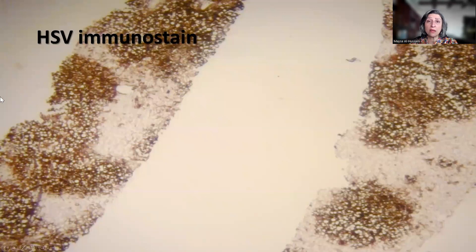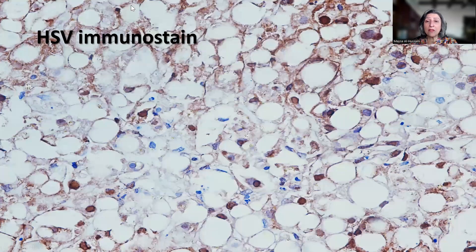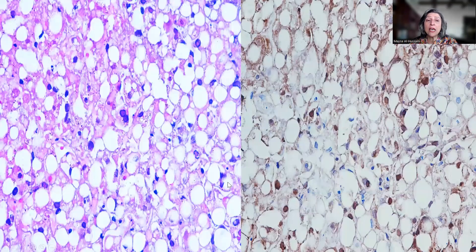Remember that we have immunohistochemistry that can be utilized. On low-power magnification, there is a massive amount of positivity, meaning the hepatocytes are infected. On high-power magnification, the nuclei show strong brown staining, indicating positivity and localizing the HSV infection into the nucleus — as was actually seen on the H&E. The H&E shows binucleation, margination, and smudging of the chromatin.